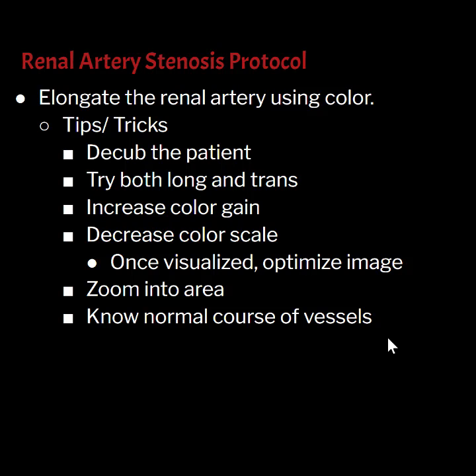Once you're able to visualize, you'll definitely want to optimize your image so you can evaluate for any stenosis or turbulent flow. You'll also want to zoom into the area. Make sure that you are enlarging that area using magnification to make it larger and easier to see.